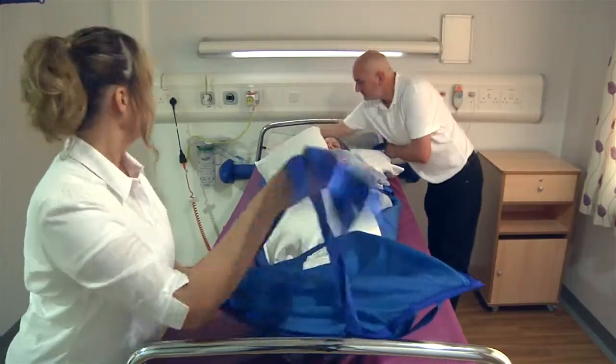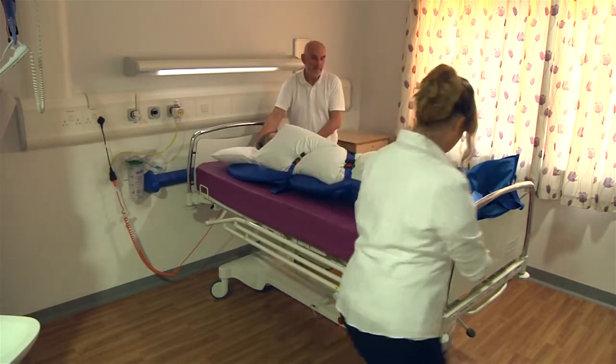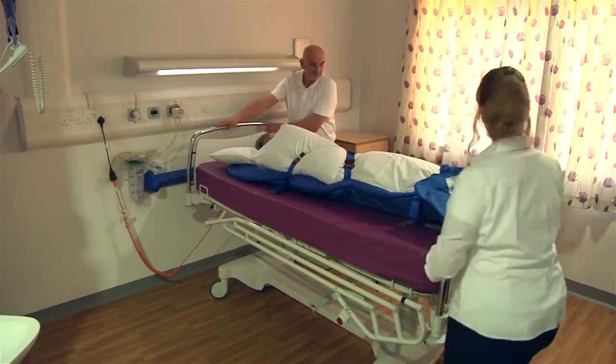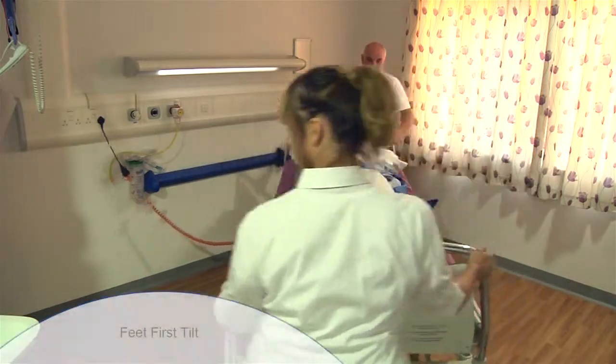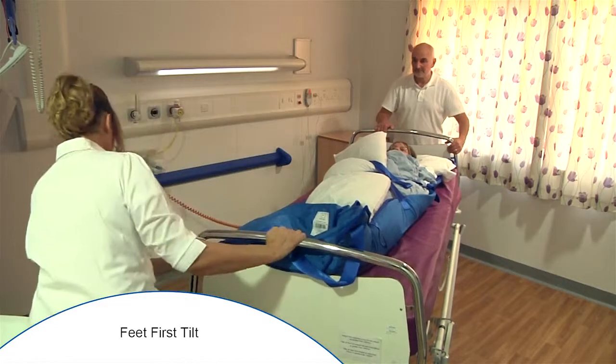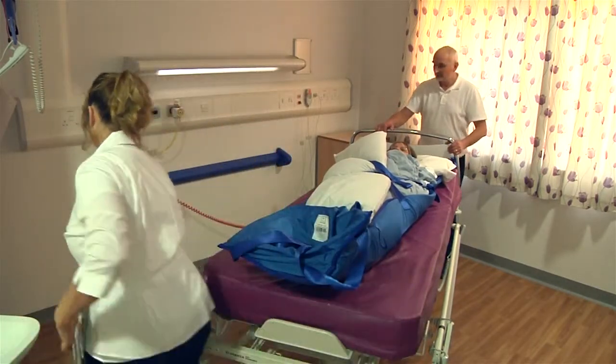Various methods of taking the patient off the bed can be used — please consult your moving and handling department to ascertain the correct method of transfer for your own specific environment. If the type of bed and space allows, the bed can be tilted towards the foot end. Remove the foot end of the bed, then lower and tilt the bed.